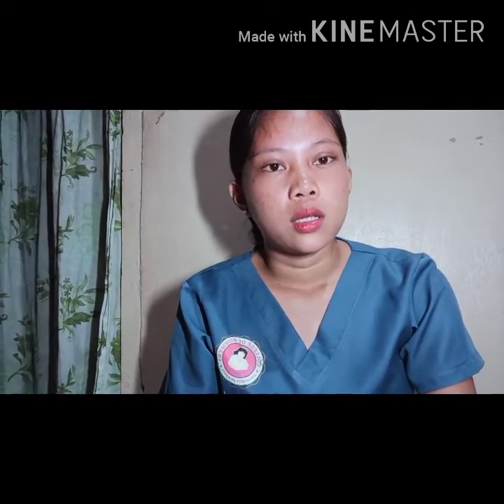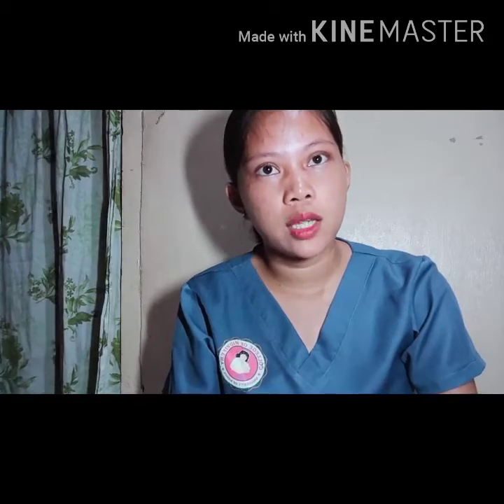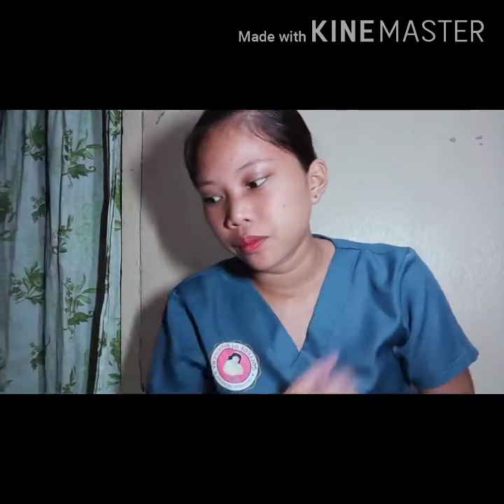So put pressure on the vein proximal to the catheter to eliminate or reduce blood oozing out of the catheter. Stabilize the hub with thumb and index finger of the non-dominant hand. So imo nga apply ng pressure kaya ron pa-reduce og kanang oozing out of blood.